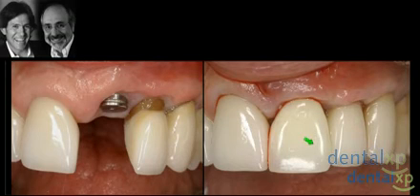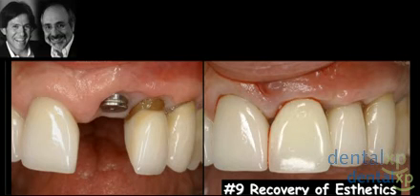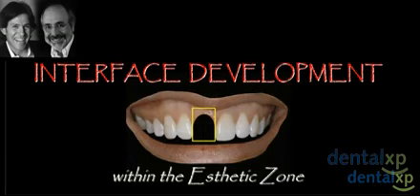But we were able to do this instead just with autogenous soft tissue, and I think in many cases, recovery of aesthetics really requires not only bone manipulation, but really soft tissue management, the ability for surgeons doing implant dentistry to understand the importance of soft tissue recovery procedures, as simply beautifully highlighted by Dennis and Stephen, utilizing a layered approach or multiple surgeries to try to reconstitute that lost tissue. Of course, always better for us to understand that it's better not to lose the tissue from the beginning and to properly analyze the case with bone sounding procedures.